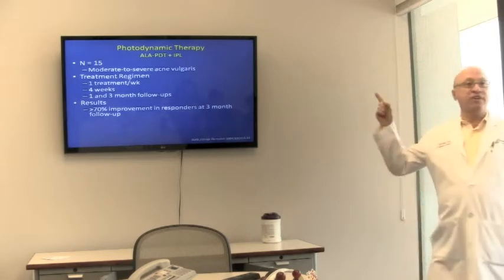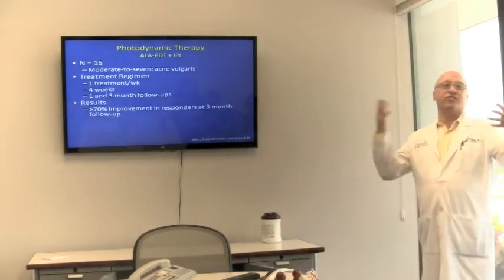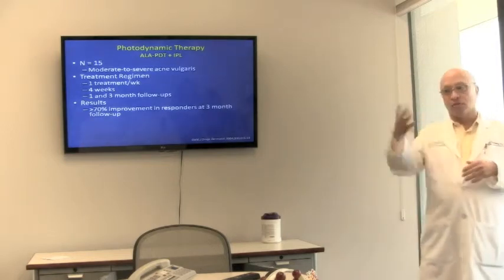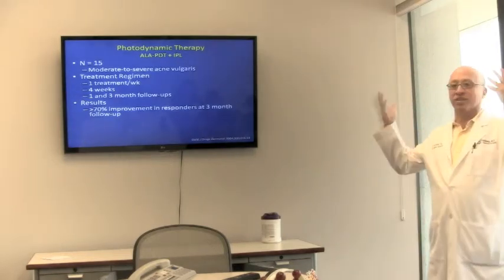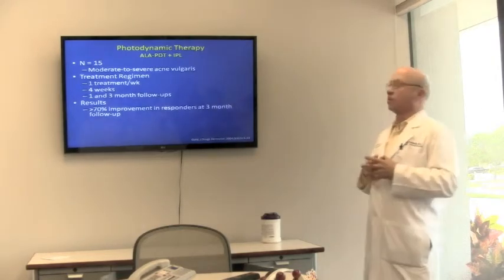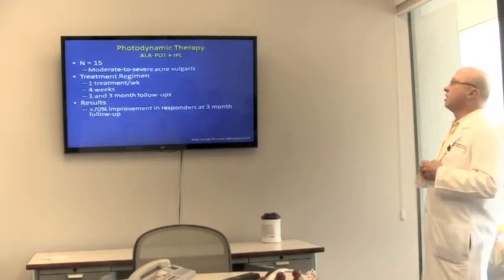When you start getting more severe acne, and it's hard to define that, but I define that as generally either teenagers or adults who have more than 10 pustules or cysts or something like that. Then we start going toward the PDT process.